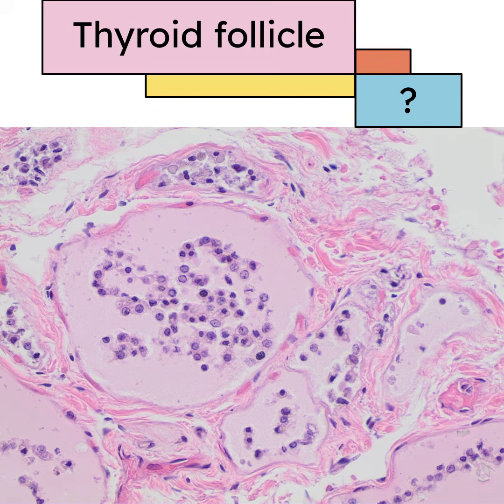Furthermore, the absence of an inflammatory infiltrate, such as the lymphocytic nesting seen in Hashimoto thyroiditis, or the multinucleated giant cells and granulomas of de Quervain's subacute thyroiditis, confirms that these epithelial changes are postmortem artifacts rather than a true thyroiditis. The stroma may show edema, but the lack of fibrin deposition or leukocyte extravasation helps the pathologist rule out acute injury. Understanding these artifacts is critical to avoid misidentifying sloughed cells as the papillary projections of a malignancy or the cellular debris of necrotizing processes.